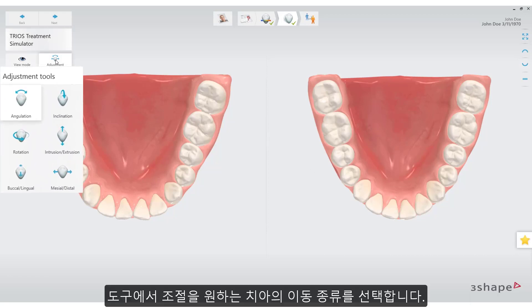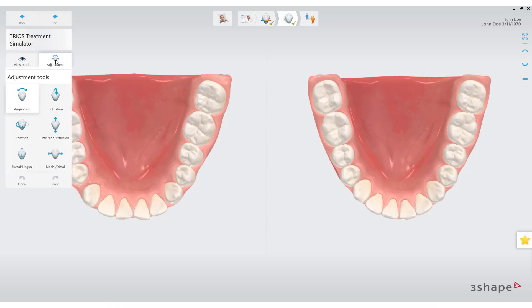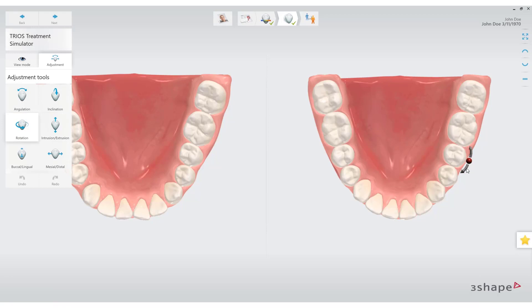Choose which kind of movement you want to perform. Select a tooth and use the controls to adjust its position.